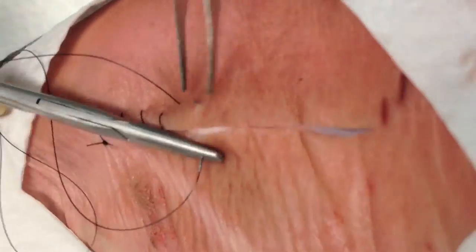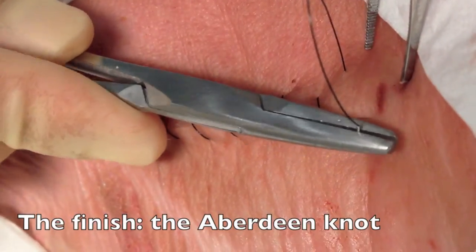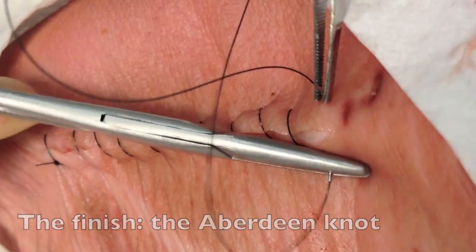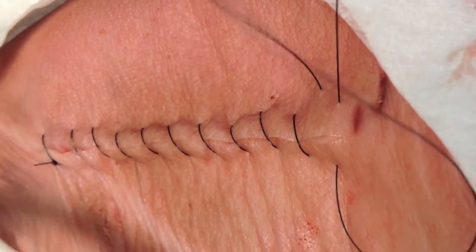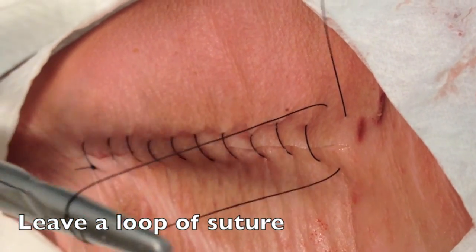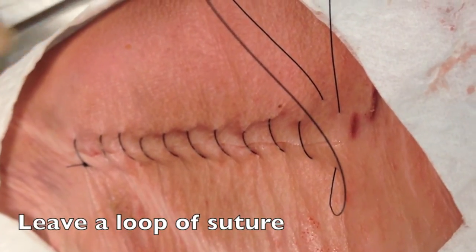We're going to continue to run the suture across the length of the wound, and now let's talk about the finish. For your final throw at the end of the wound, rather than pulling the suture material all the way through, you're actually going to leave a loop of suture behind. This is going to allow us to form what's called the Aberdeen Knot.